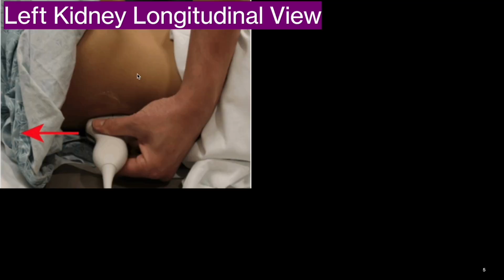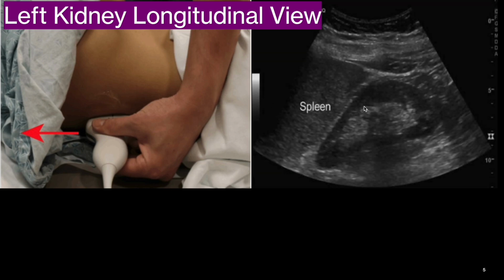In this image, we are trying to visualize the left kidney in longitudinal view. If we put the probe like this in the posterior axillary line on the left side, we see this type of image. So this is the spleen. On the right side, we see the liver in this area, but on the left side, we see the spleen. The echogenicity of the liver and spleen is almost similar and both are homogeneous structures. So this is the left kidney.